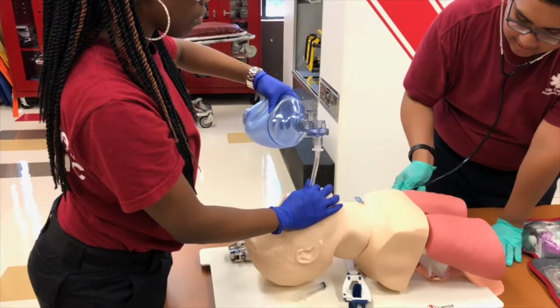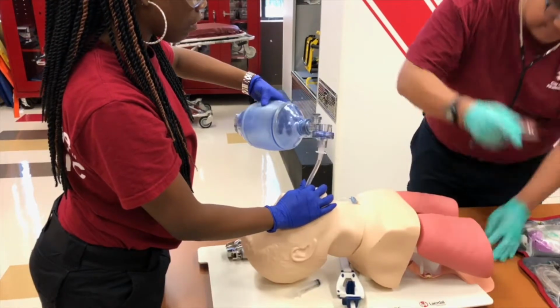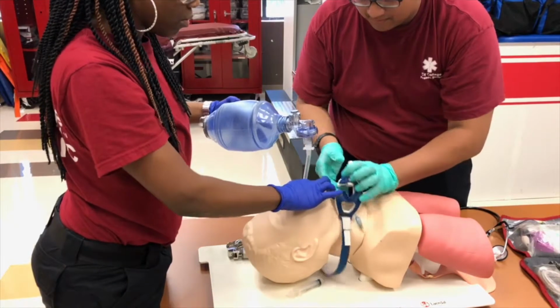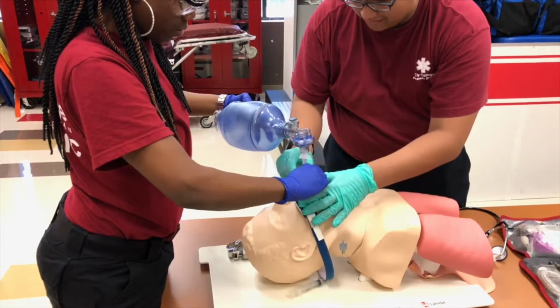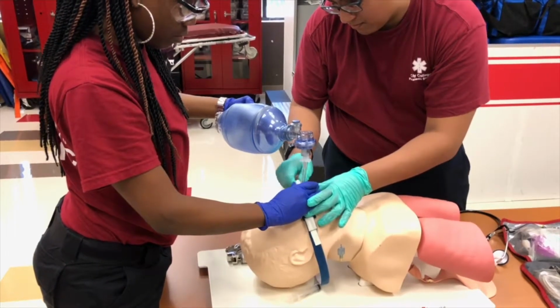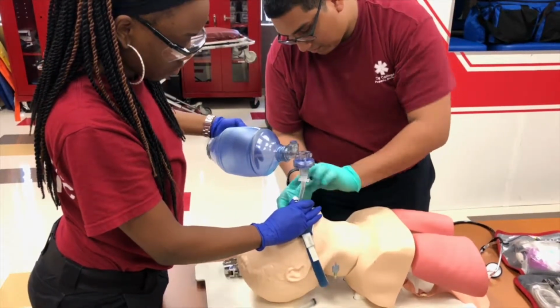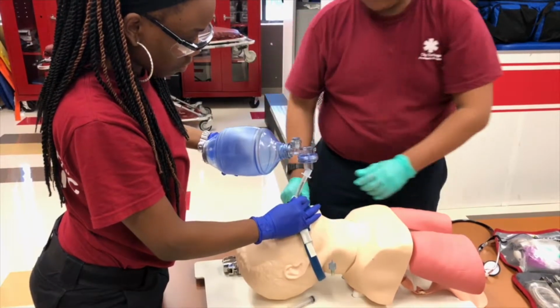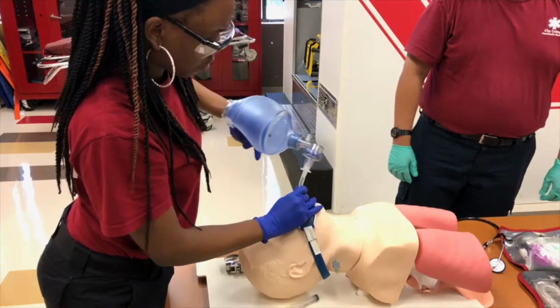Clear. To ensure proper placement. Clear. Once you've ensured proper placement, you're going to secure the ET tube with a Thomas tube holder. Once it has been secured, you have successfully intubated the patient.